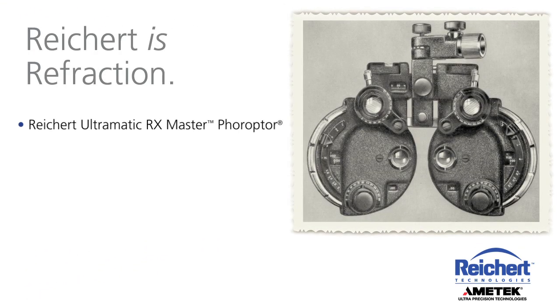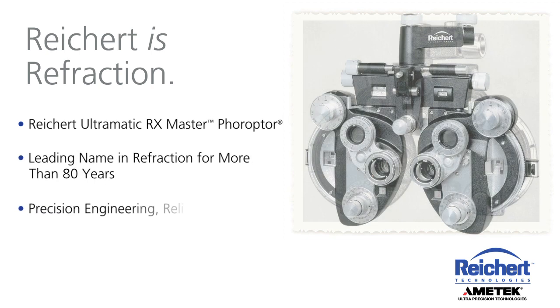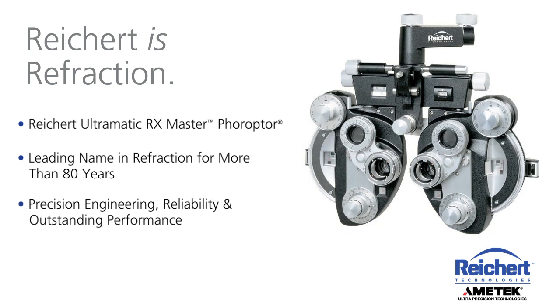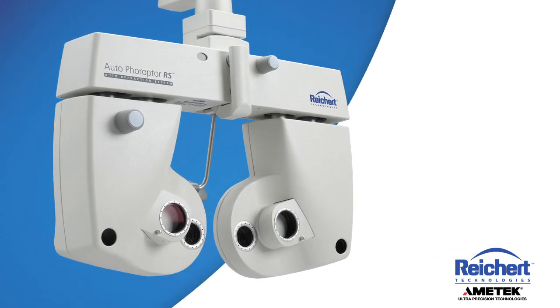The Rikert Ultramatic RX Master Phoropter has been the leading name in refraction for more than 80 years. The same precision engineering, reliability, and outstanding performance of the Ultramatic RX Phoropter are incorporated into the Auto Phoropter RS Auto Refraction System.